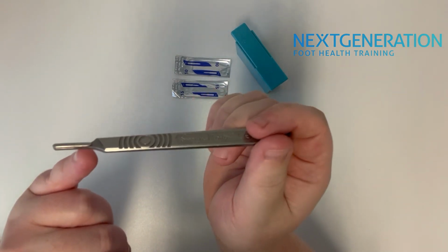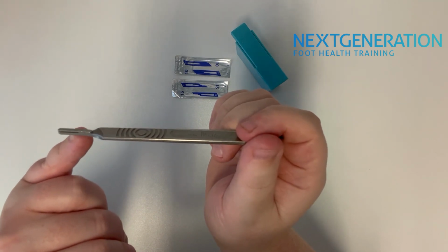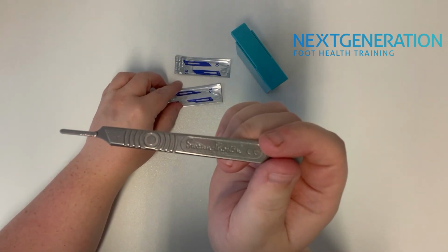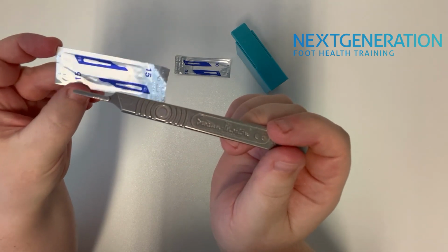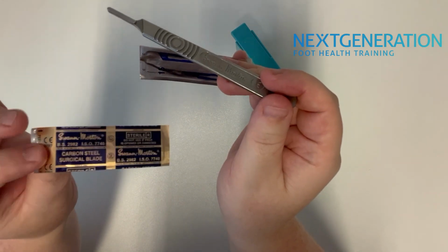And we've also got a groove, I don't know if you can see it very well on the camera, running around the tip of the handle piece, and that's important as well for when we're applying blades. I've got 2 of the most popular blades here as well, which is a number 15 scalpel blade and also a number 10, and these are Swann Morten blades as well.